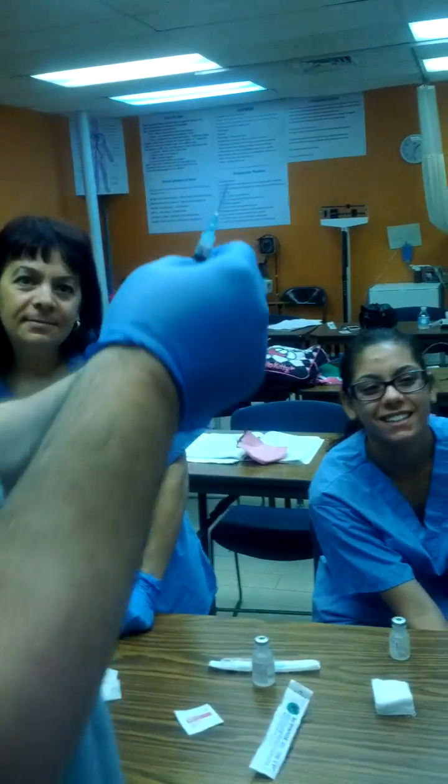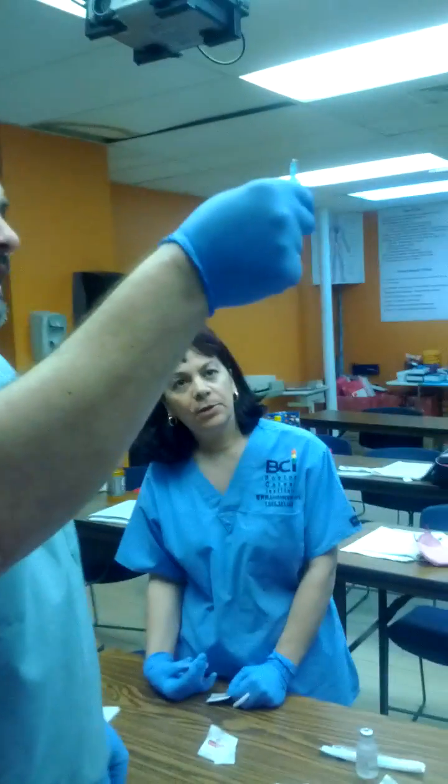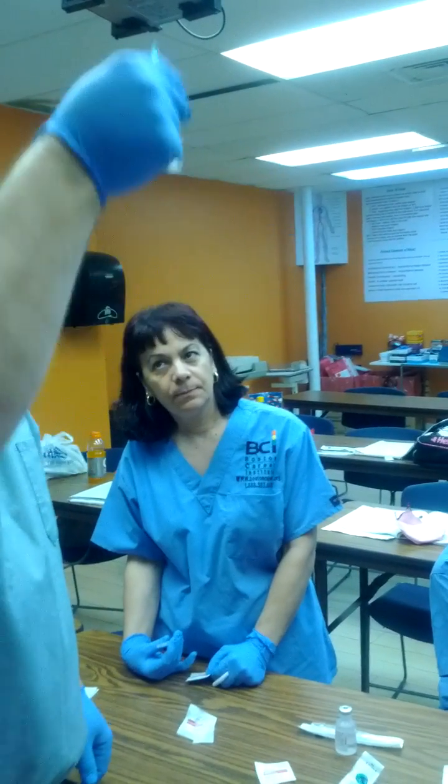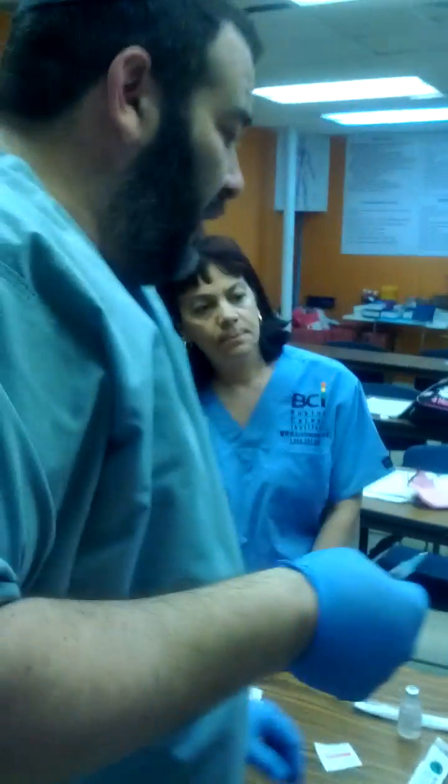I've got my syringe. I know that it's checked for proper dosage and I don't have any air bubbles in there. I'm going to hold it just like I'm doing it for a blood draw or an intradermal injection — with these three fingers, with the bevel facing me, or up in this particular way.